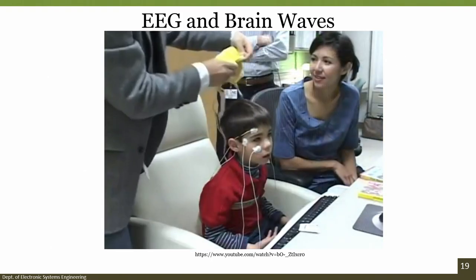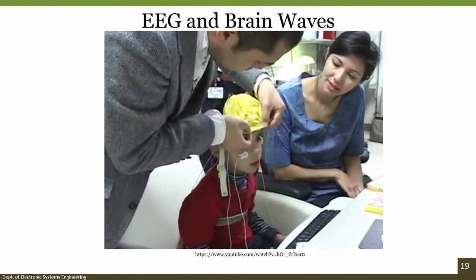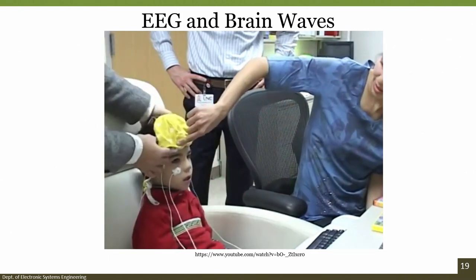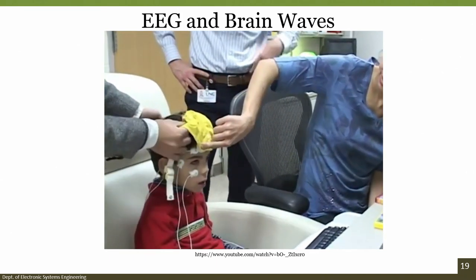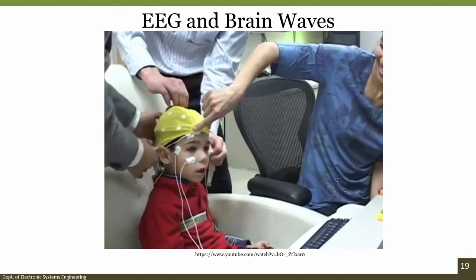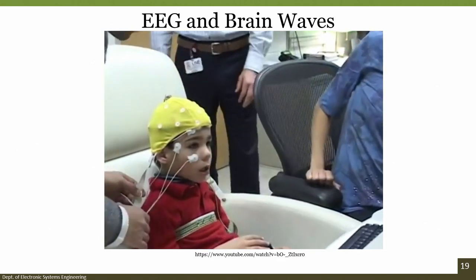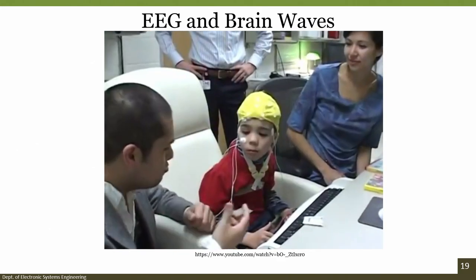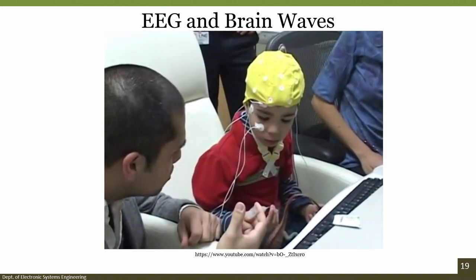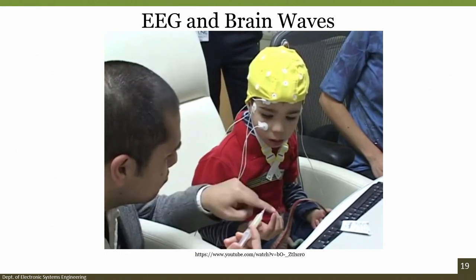When he's done with the stickers, he'll put the cap on your head. While they were putting the cap on, they explained the different steps so that nothing came as a surprise. Then, using the syringe he showed you during playtime, he'll put some cold gel in each one of the holes in the cap.